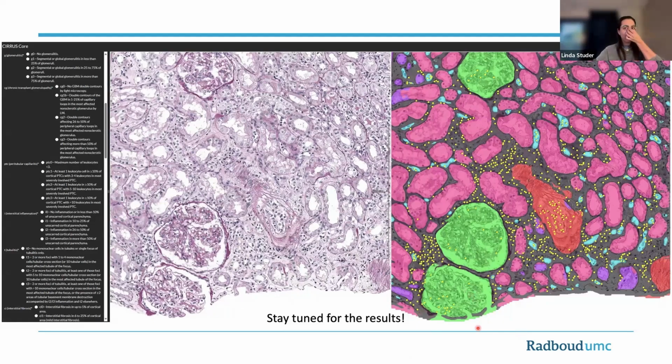Yeah. So the border is always a bit of a challenge, because generally we use a two-step approach where we first have a network that segments the tissue areas on the slide, so that we can focus the application of the algorithm just on the detected tissue. This usually has some margin of error, which you can see bleeds a little bit out here, especially if we have fatty tissue on the slide. To be honest, I am not super sure how to deal with this.